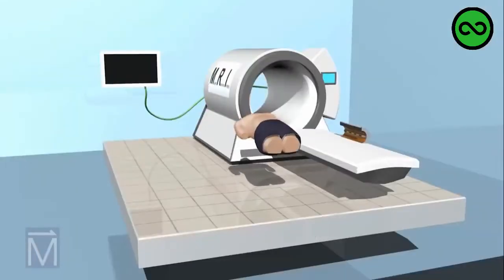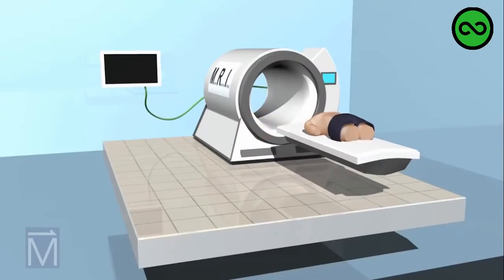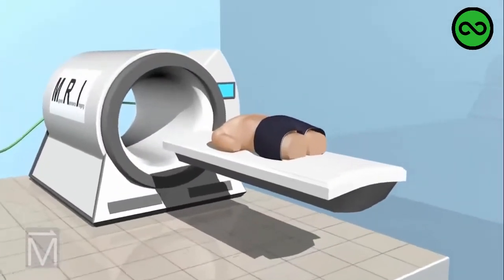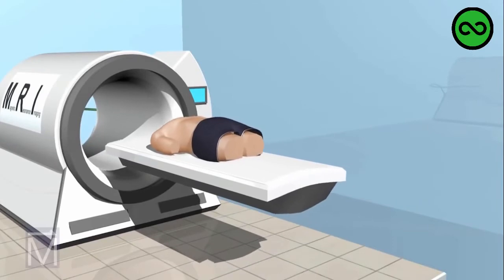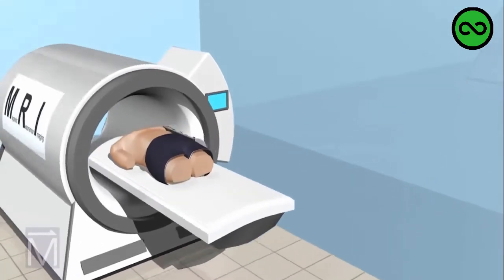Normally, these hydrogen protons spin about willy-nilly on randomly oriented axes. Put them inside an MRI machine, however, and things change.